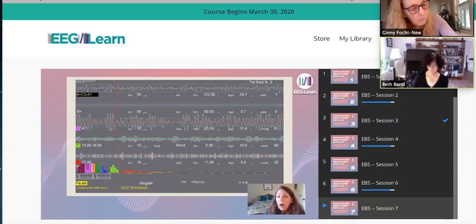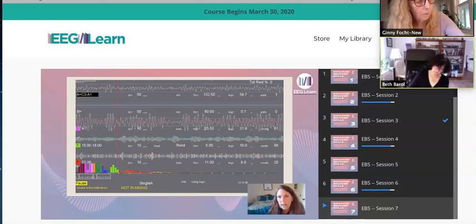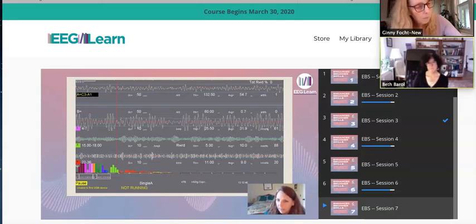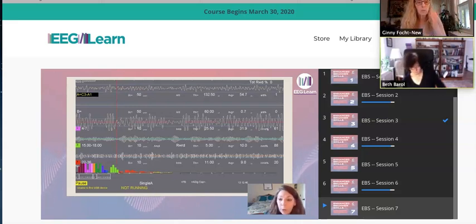Long Term is just a line graph of the brain waves like you see on the review screen, but you're watching it unfold in real time across the screen. And the violet line corresponds with the slow wave activity in the Long Term game. So if that was the target of your training, you could call your person's attention to that line and say, see if you can make that violet line go down.